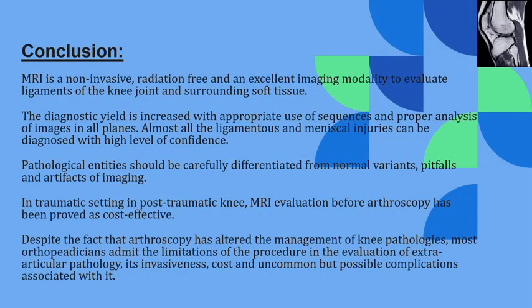What is the conclusion of our study? The MRI is a non-invasive, radiation-free, and an excellent imaging modality to evaluate ligaments of the knee joint and surrounding soft tissue. The diagnostic yield is increased with appropriate use of the sequences and proper analysis of all images in all planes. Almost all the ligamentous and meniscal injuries can be diagnosed with a high level of confidence.